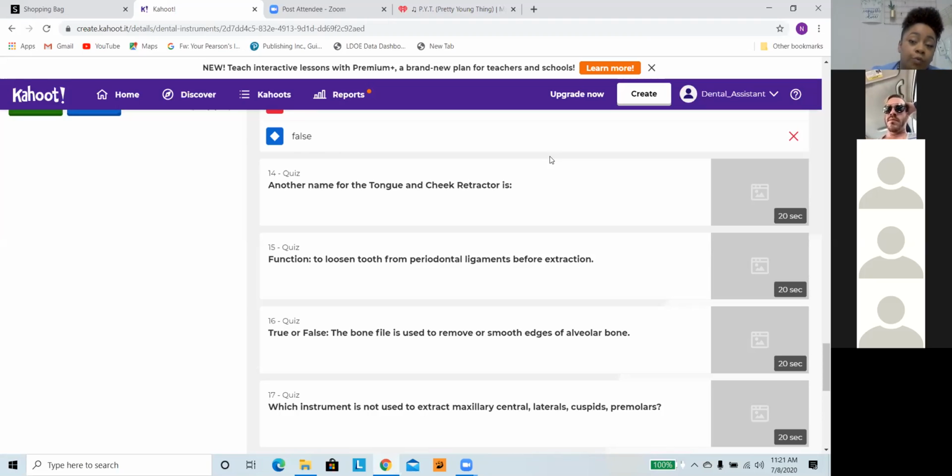But you'll see it a lot more in the endo tray because we are taking infection out of the tooth, removing the nerve, and using house bleach to cleanse inside of that tooth. It's a lot of little knickknacks.